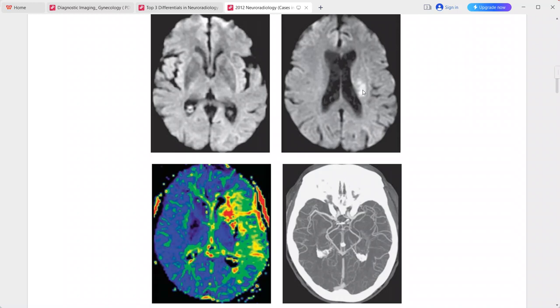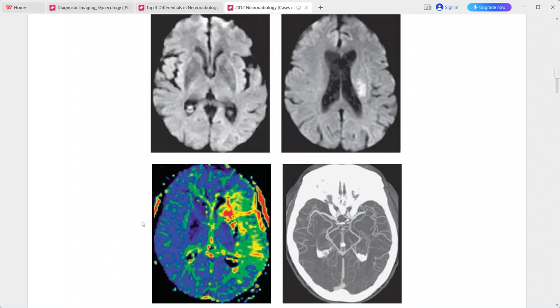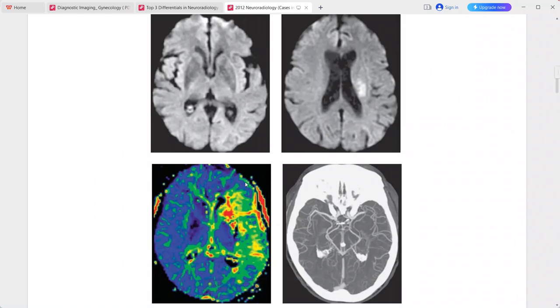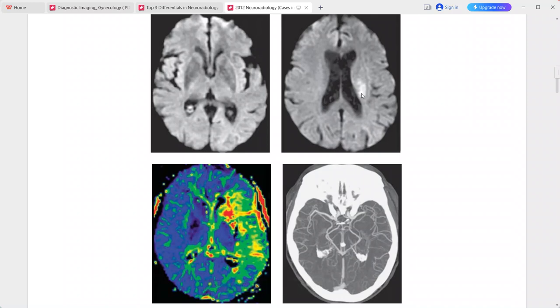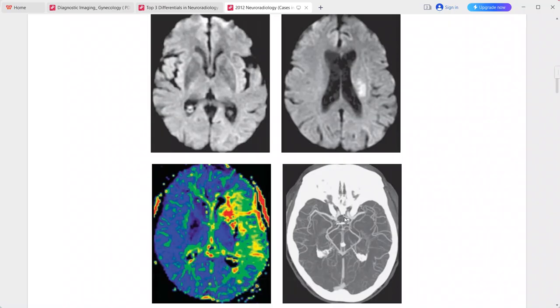Mean transit time mapping using dynamic susceptibility contrast perfusion reveals a region of prolonged transit time, with relative hypoperfusion much larger than the DWI abnormality — demonstrating a perfusion-diffusion mismatch.